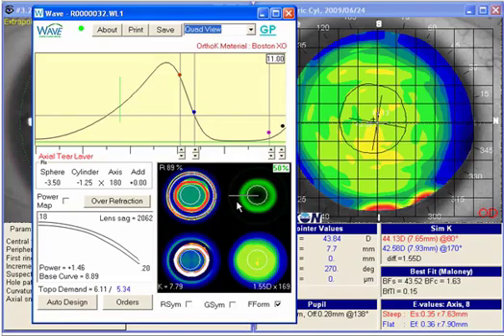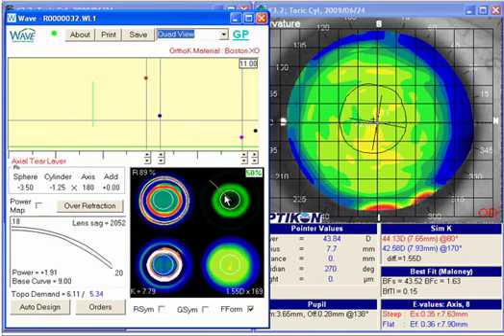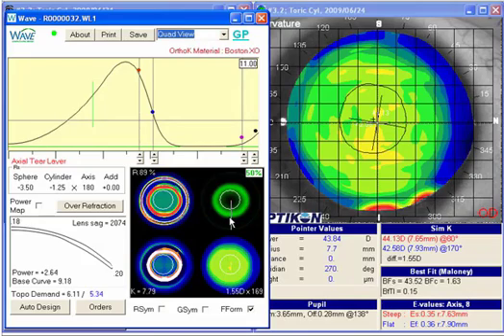Now with that said, you should be able to look at a cornea and note whether or not we have a really good chance of the lens aligning here. Now this cornea looks a little bit steeper inferiorly, so we get a little more of this light green coming down through here, where up here it's not so much, maybe a little band, but we really have the heavier green coming in a little faster. Therefore, the cornea is different out in the periphery. The lens probably will align just as we want, and this Ortho-K lens will probably treat most of that still as we are anticipating. And that's really it.